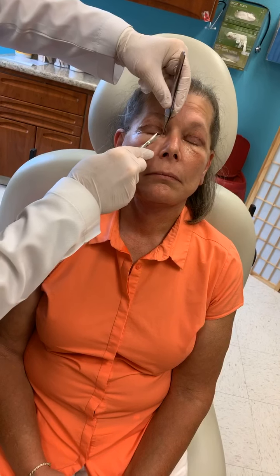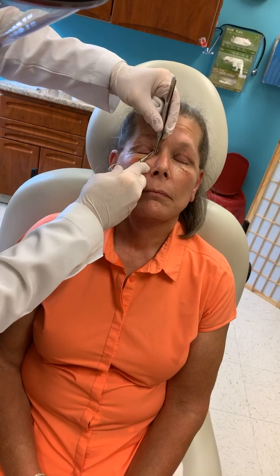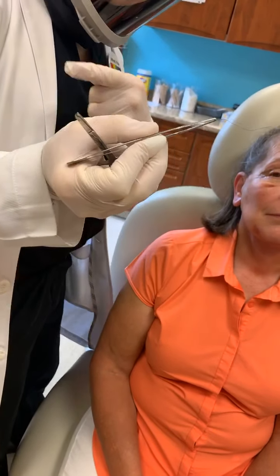This is a running subcuticular suture. In our blepharoplasty, I leave the muscle, I leave the fat, because you don't want to prematurely hollow the area. So you can fill hollows with filler and volume, but when you take the excess skin in the right patient, it's a perfect way. And there's the little stitch. It's one stitch that goes all the way across.